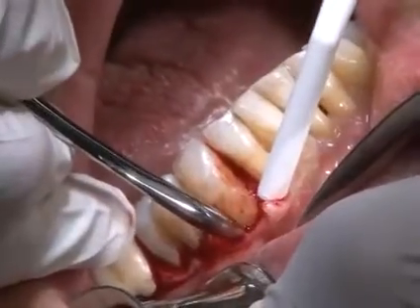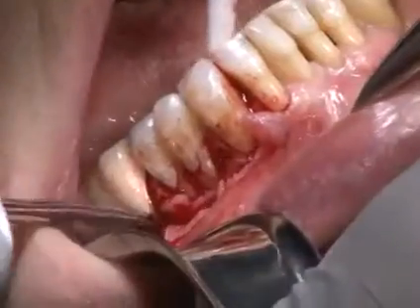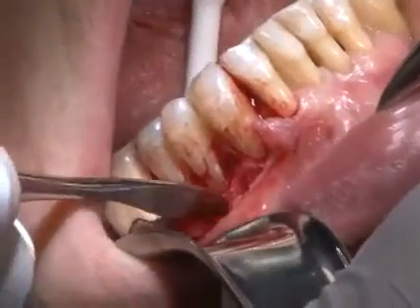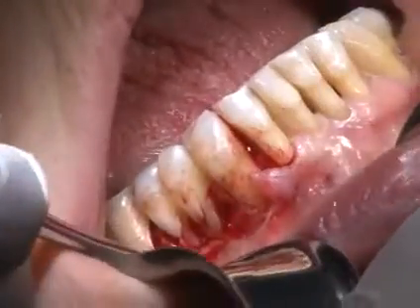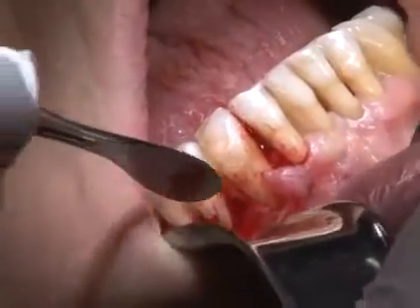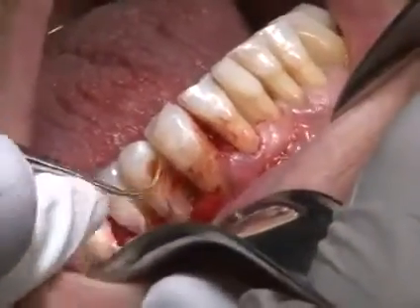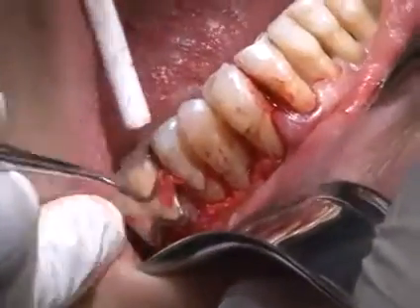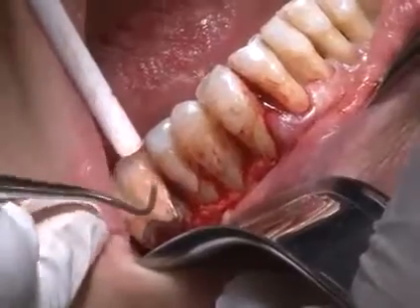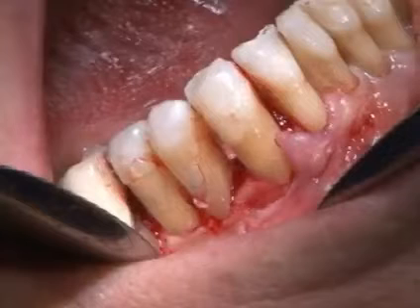Ample flap reflection and flap relaxation is important. The flap is extended mesiodistally at least 1 or 2 teeth on each side of the anticipated site of bone removal. Typically, there is pronounced bleeding in the surgical sites. Hand curettes and ultrasonic instruments are used to remove granulation tissue in the defect. After complete removal of the granulation tissue, there is minimal bleeding, and the root surface and the osseous defects can be visualized.